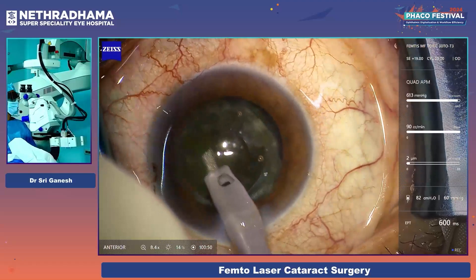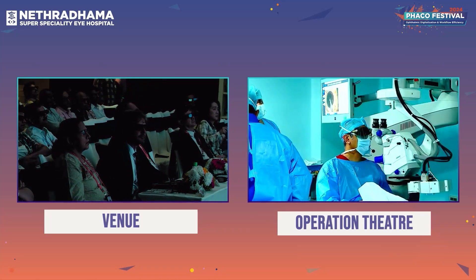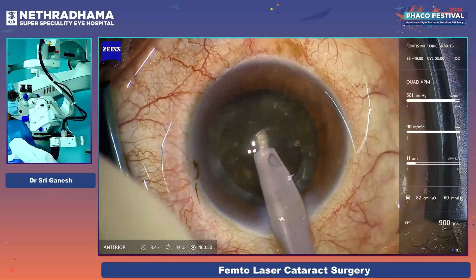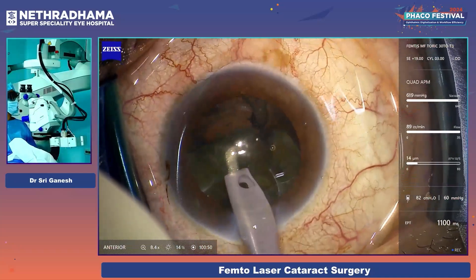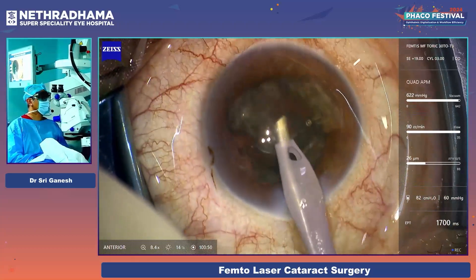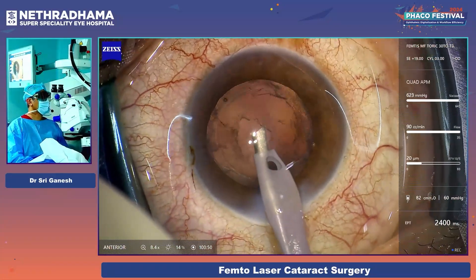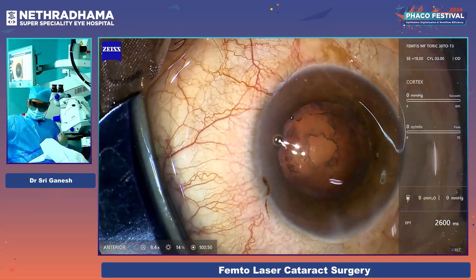Regarding the advantage of the new tip — this is a grade 2 cataract. I am just flipping the epinucleus now, and you can see that the chamber is very stable and the followability is excellent. With the Quatera, we have evacuated the cataract. This is a single-handed technique with the Viscoat chop.